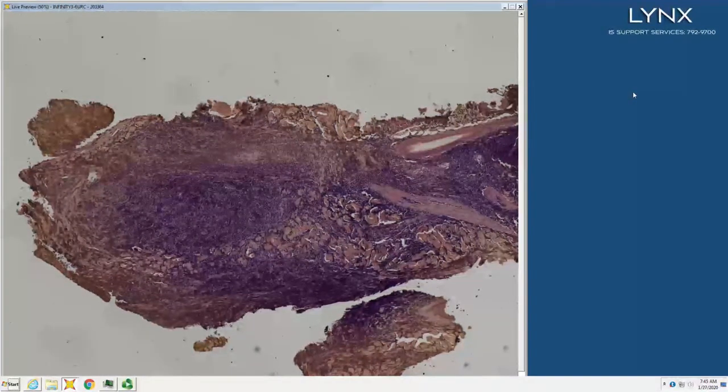That crush is also a hint to lymphoma. You have your coarse collagen bundles, and you can see how those lymphocytes are really densely intercalated between those collagen bundles, and then there's peripheral crush.